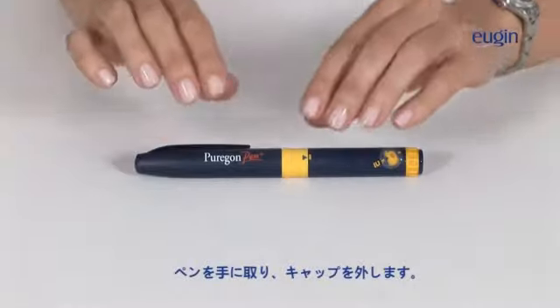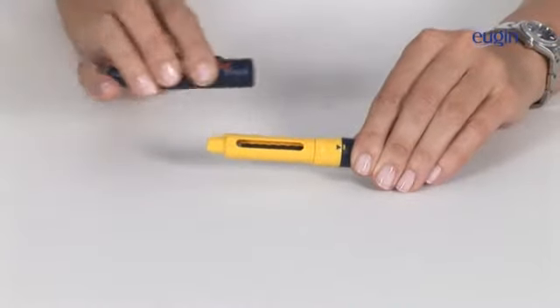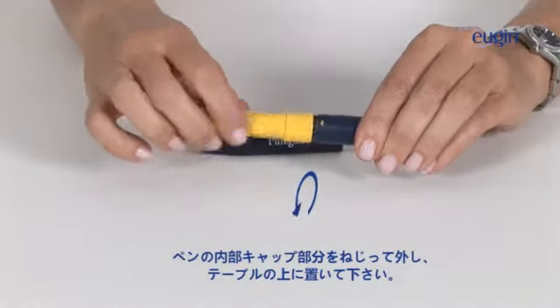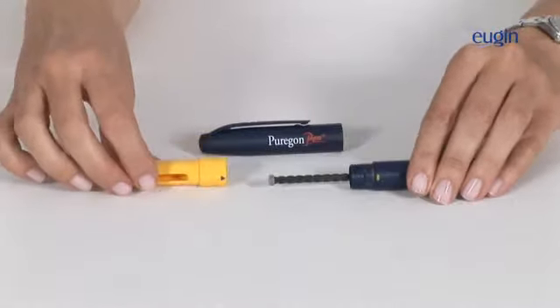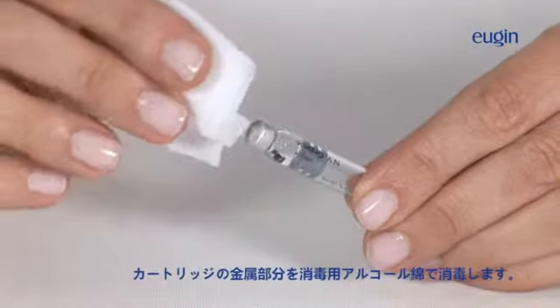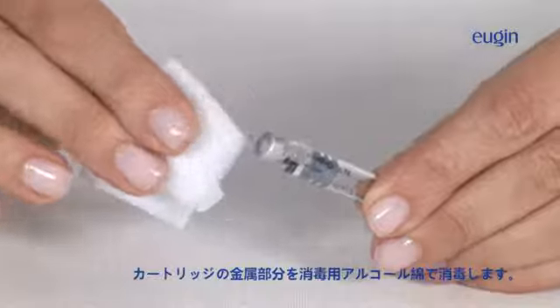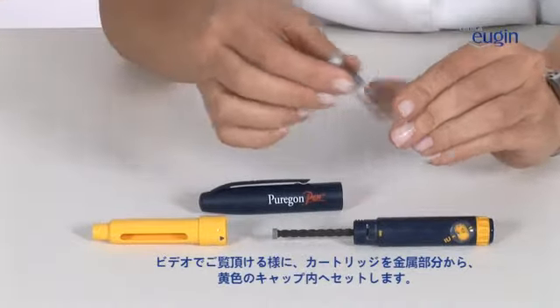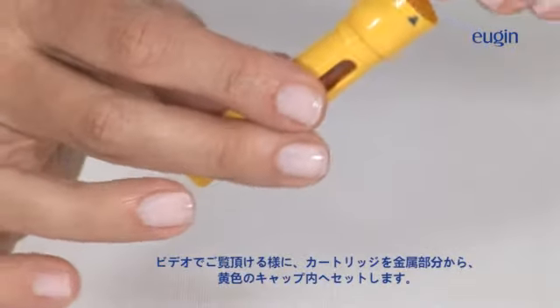Take the pen and remove the protective cap. Now, unscrew the pen and leave it on the table. Pick up a cartridge and clean off the metallic part with alcohol and gauze. Now, insert the cartridge, metallic end first, into the yellow support as seen in the image.